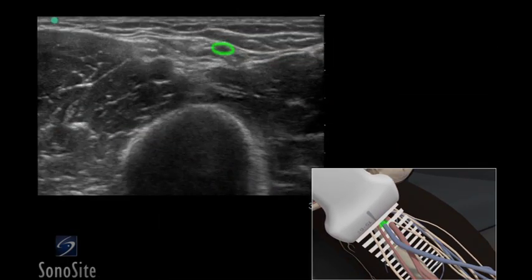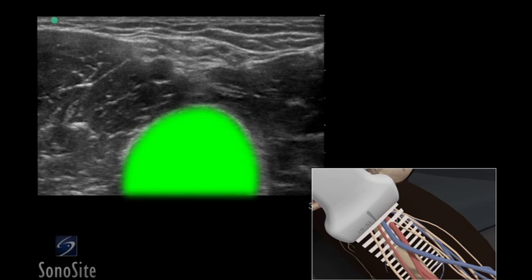The basilic vein is seen as a dark anechoic circular compressible structure in the mid-portion of the ultrasound image, between the biceps and triceps muscle. Deeper and slightly to the right of the screen, the bright hyperechoic humerus can be seen.